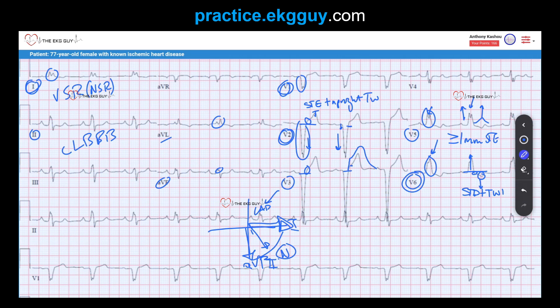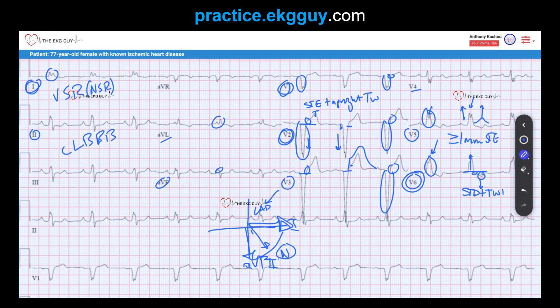Be cautious of left bundle branch block causing pseudo-infarct patterns, where it mimics an anteroseptal MI. You could see QS complexes in leads V1 to V3 and even up to V4 with ST elevation, which could mimic that pseudo-infarct pattern of an anteroseptal MI. Less commonly, you could see a pseudo-infarct mimicking an inferior MI, with Q waves appearing in the inferior leads. We don't see any Q waves in the inferior leads here, but that's one thing to keep in mind.